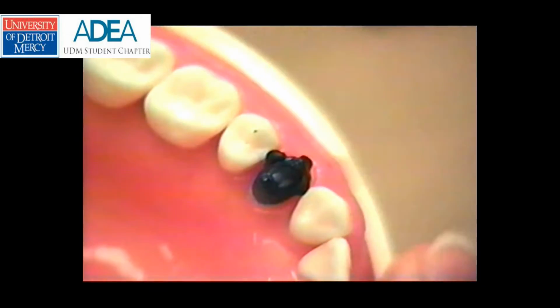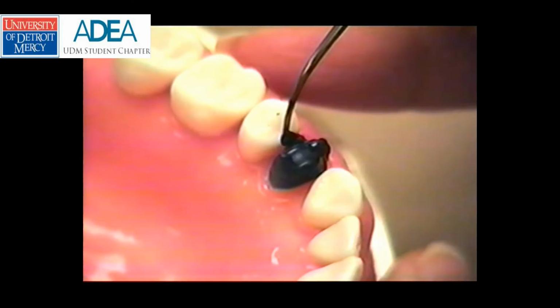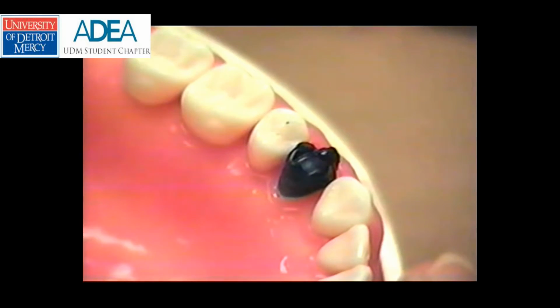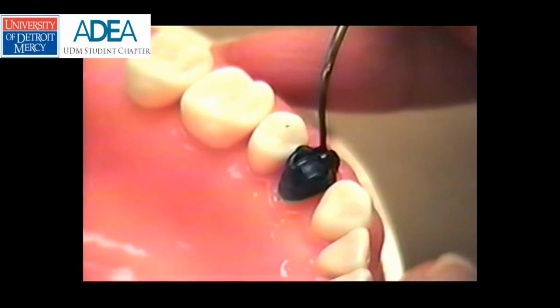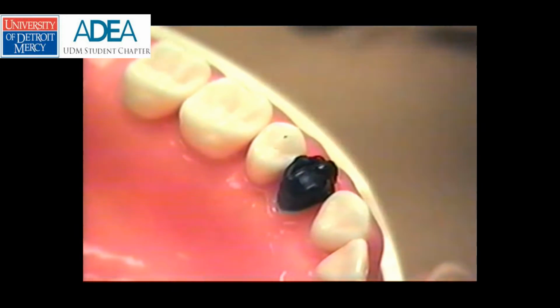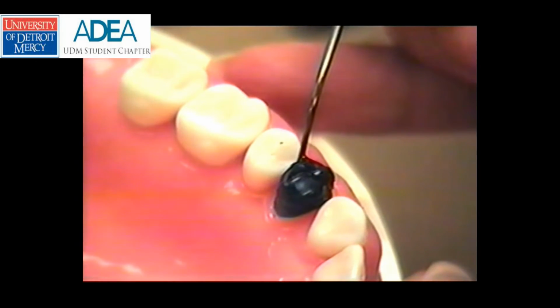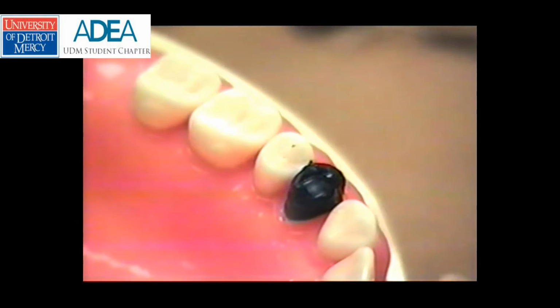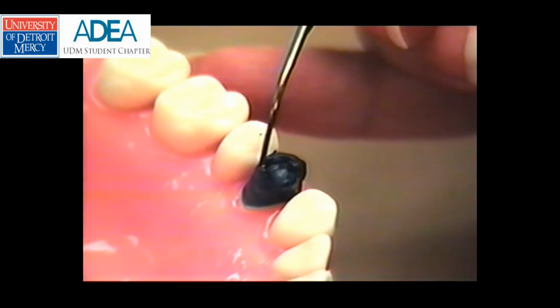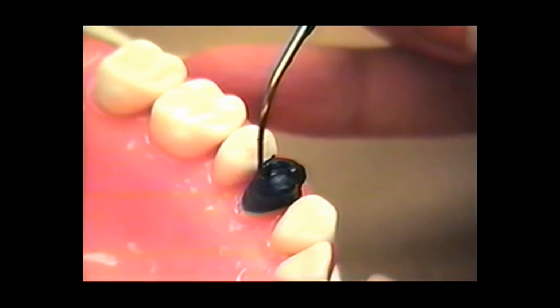And what I would do now is start to develop a marginal ridge. Let's do it at the distal here, just to get an idea of what height we need to be at, remembering that the marginal ridges all line up. They're all the same height. And I'm going to do a cusp arm here. Distal facial, right from the cusp tip down to your marginal ridge. And you can do the same thing on the lingual. If your wax gets too cool, you just heat up your instrument and melt it back a little.